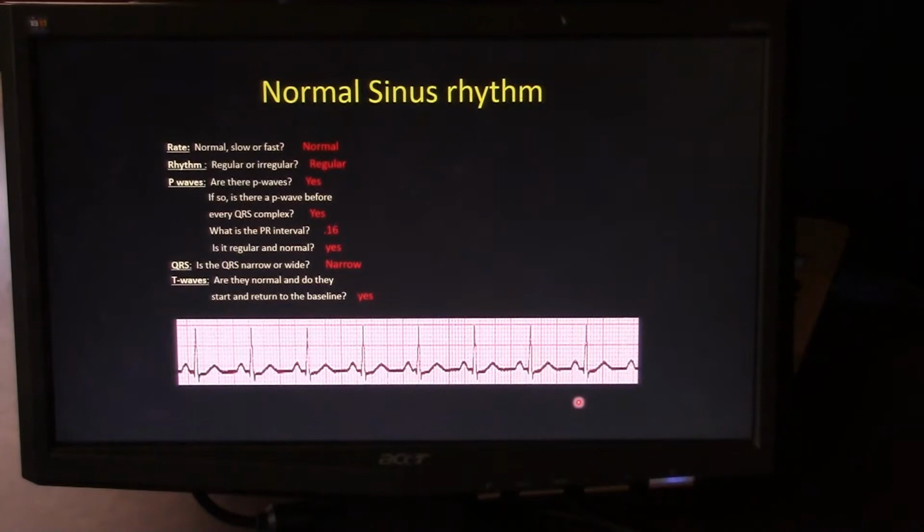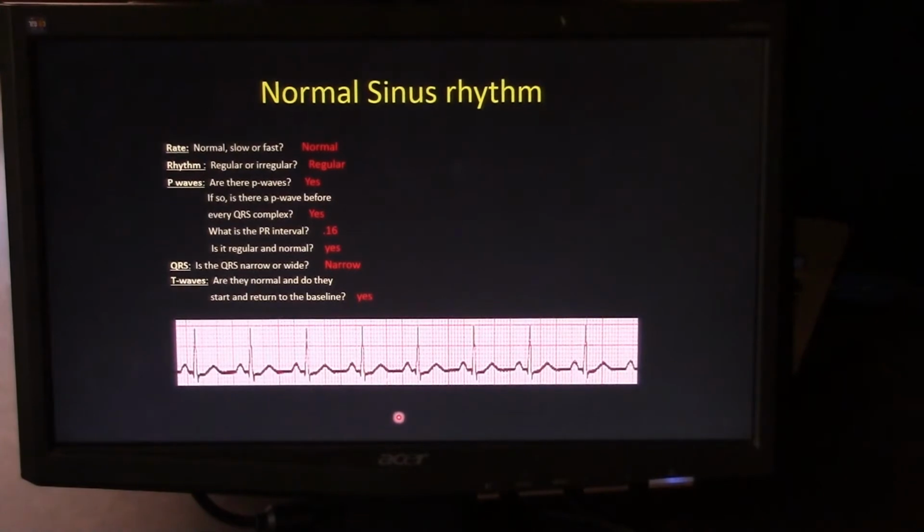Now I do want to mention there is a QTC interval that is even more significant than just the QT interval. A QTC interval is the same thing, except it's adjusted for the patient's heart rate. That should be never longer than 0.44 seconds. But if you just look at the QT interval, if you can't remember that, and it's less than 0.50, that should be adequate unless you work on a specialized cardiac unit where it requires you to look at the QTC as well.